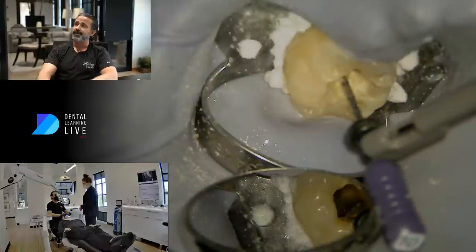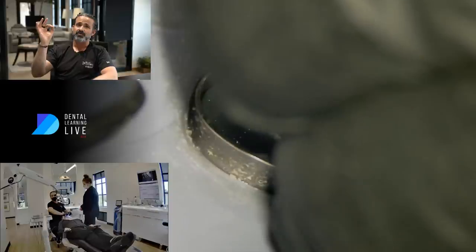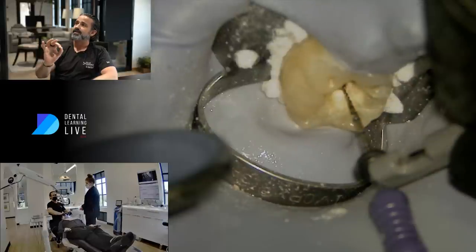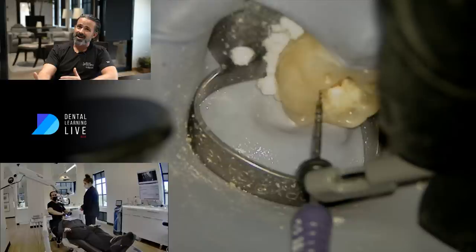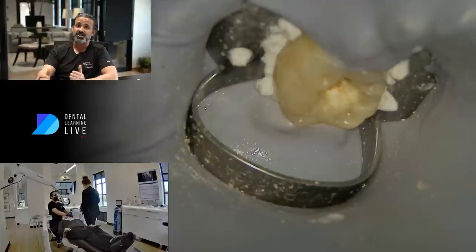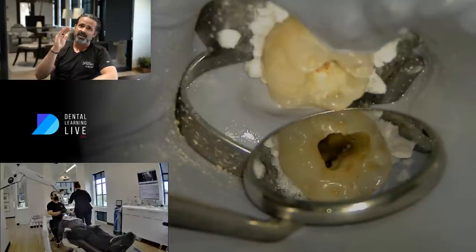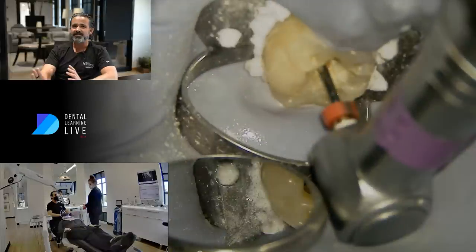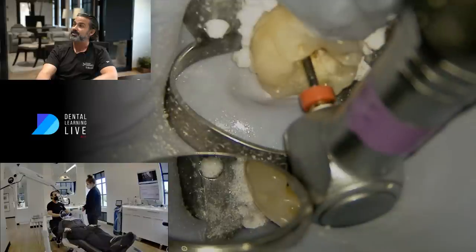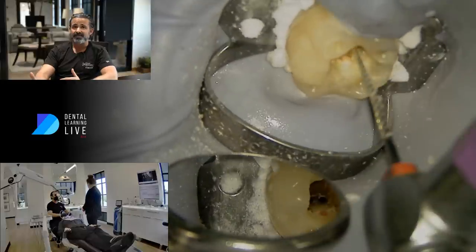I'm going to try to get the apex locator to match up and confirm what I already thought as far as length goes. I always was taught a patency pullback — meaning I would drop that apex locator out the apex and then pull it back in, and that pulling in was how I determined the most accurate length. But now it's a little bit different. I want to know the ballpark of the length, and that's what's changed using the GenoWave procedure. So I'm going to go down and follow the gauge on the electronic apex locator, but I'm not going to go out. I didn't do patency pullback with the EAL. Then I'm taking a 15/04 and placing it down to that electronic apex locator length, staying a millimeter shy. I'm now into pulp tissue in the mesial roots as I've worked my way apically.